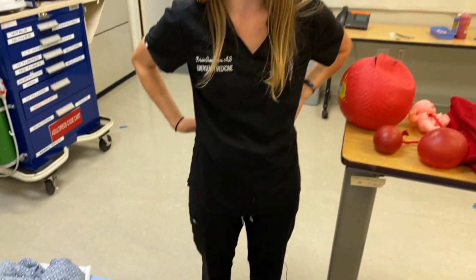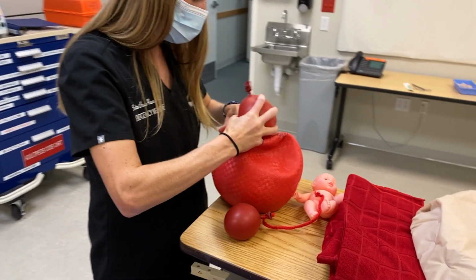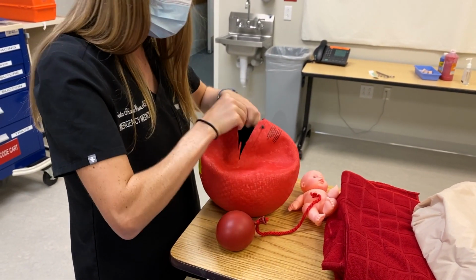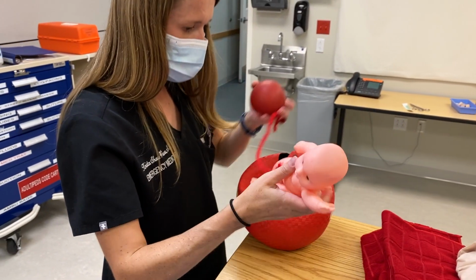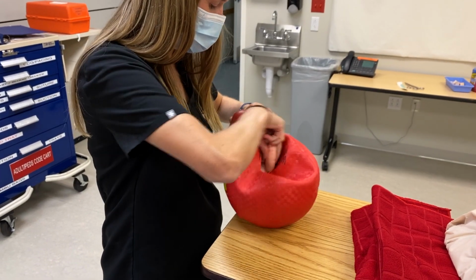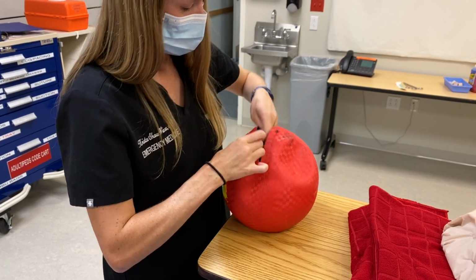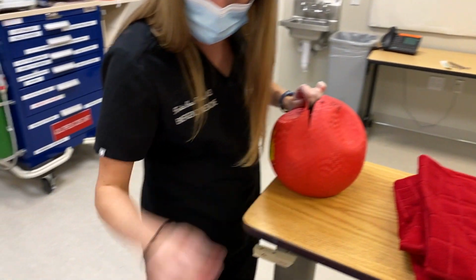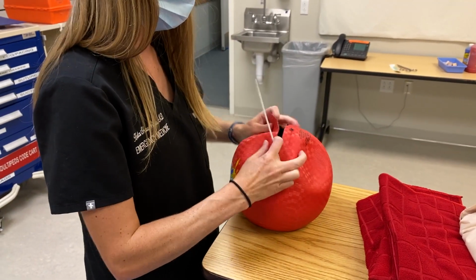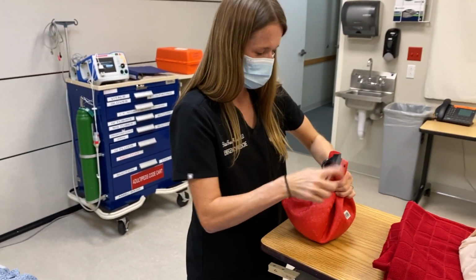Yes. Okay, so let's assemble it now. Okay, so we'll put our amniotic balloon in first. And then we'll put baby with the placenta in. And then we have a zip tie to package this all up. And hopefully I will be able to do this on my own.